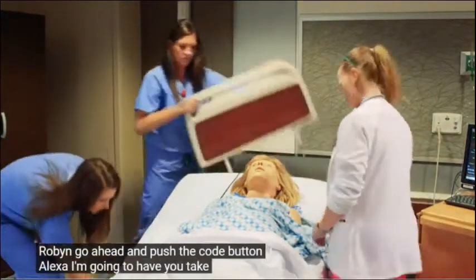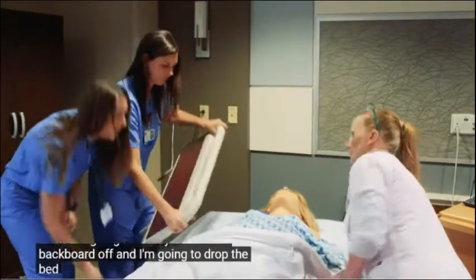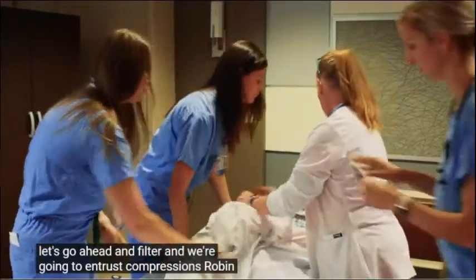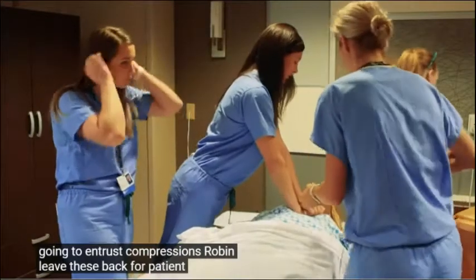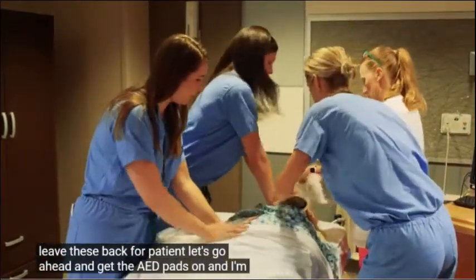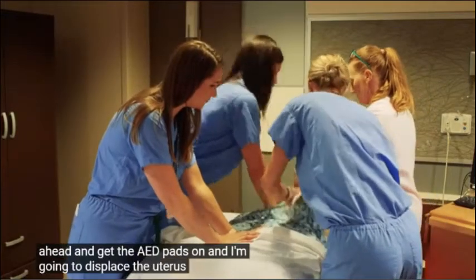Alexa, I'm going to have you take the backboard off and I'm going to drop the bed. Let's go ahead and tilt her and we're going to begin chest compressions. Robin, will you please back the patient? Let's go ahead and get the AED pads on and I'm going to displace the uterus.